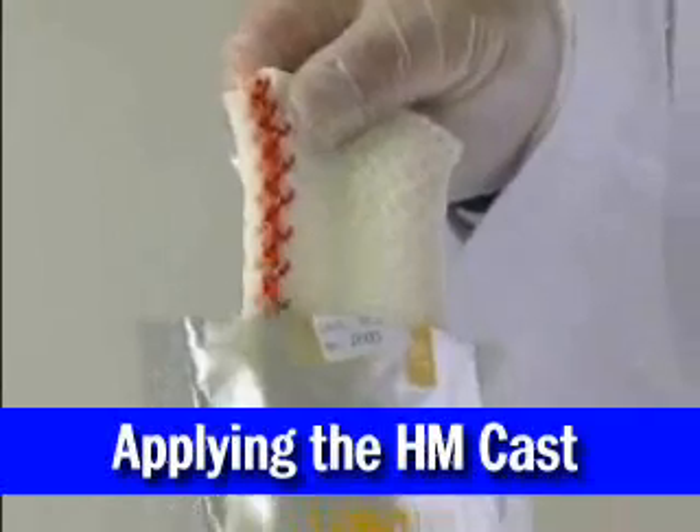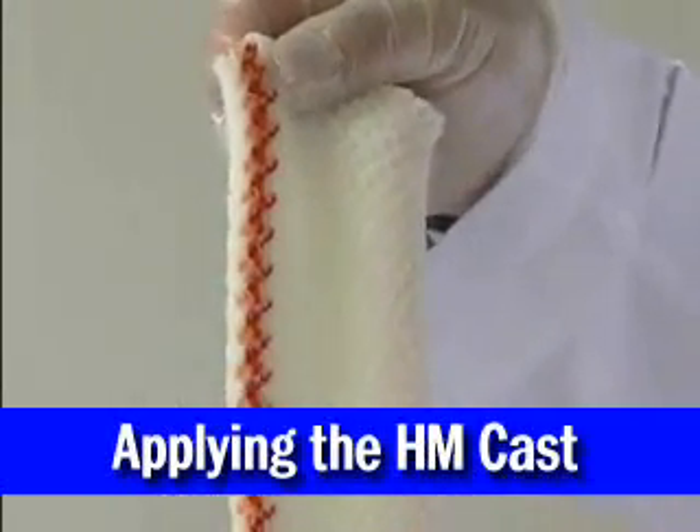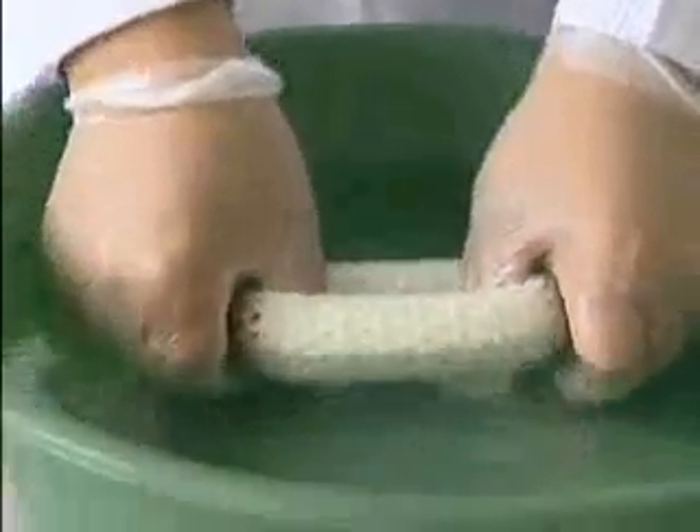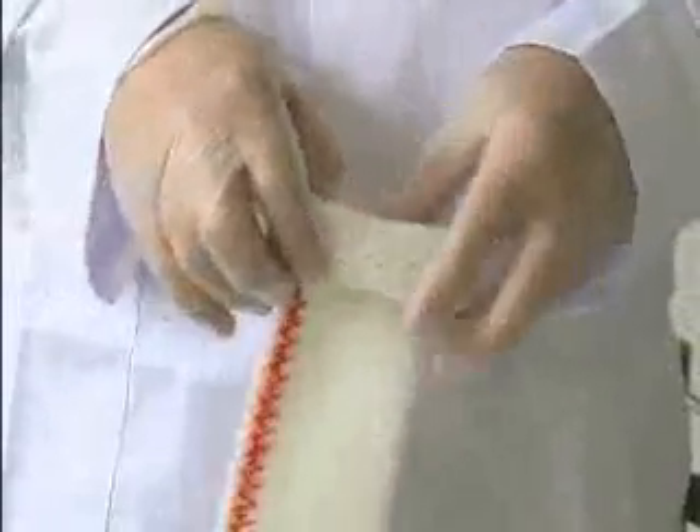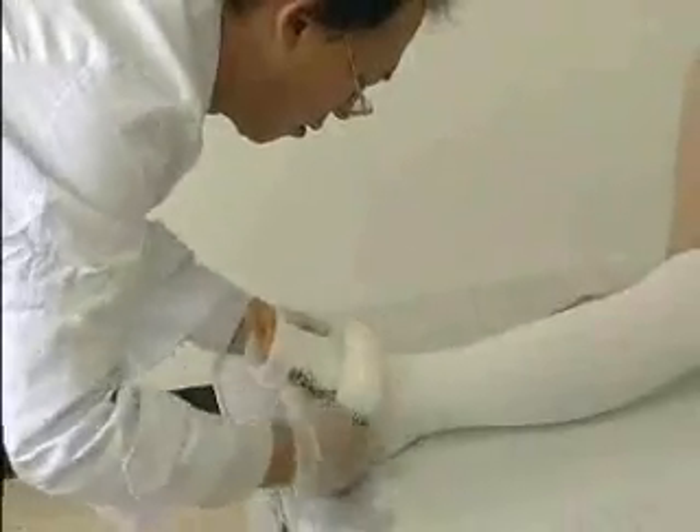Then, remove the stocking-like HM cast from its vacuum packaging and immerse it into 20 degrees centigrade water for 3 to 4 seconds. Afterwards, wring out the excess water, roll it up like a donut, and roll it up over the protective lining.